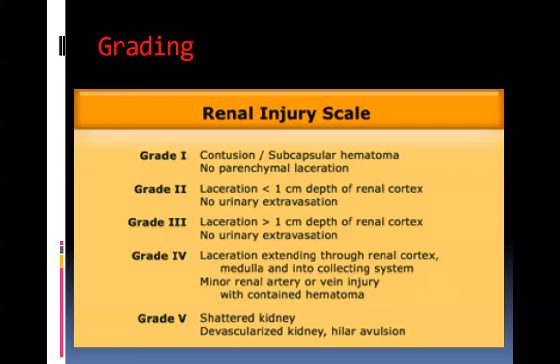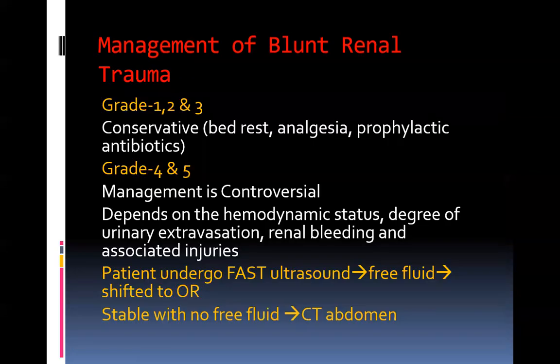So you know that there'll be fluid inside. If the blood is leaking inside, you'll see a lot of blood collecting inside. The urinoma or urine collection would be just all around the kidney, so it'll be limited to the capsule. Remember the Gerota's fascia I told you? The disease process is limited by those fascias. Don't worry if you don't understand. I'll show you examples. It makes more sense.